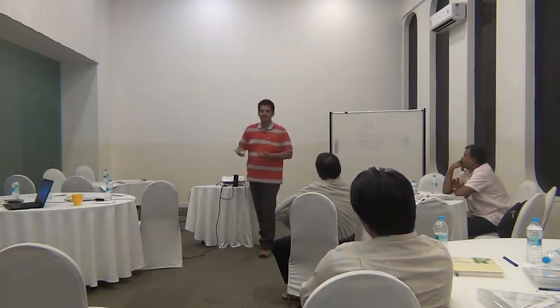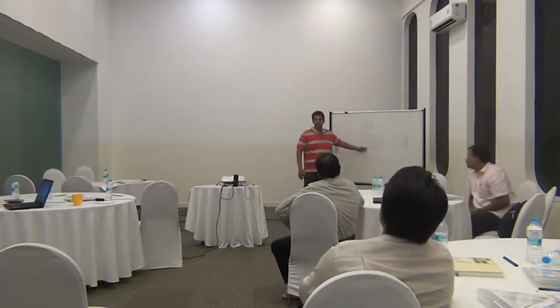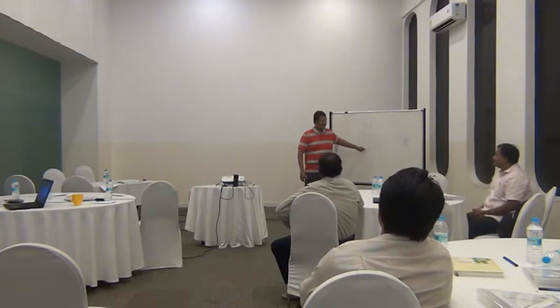What is so special about this MRI is it does not use any harmful radiation. If you take your X-ray or a CT or a PET scanning, wherein you use a lot of radionuclides, you use a lot of X-rays. In MRI you don't have any harmful radiation reported so far. That's a very good advantage of MRI. So that's about imaging. What is to do with magnetic?